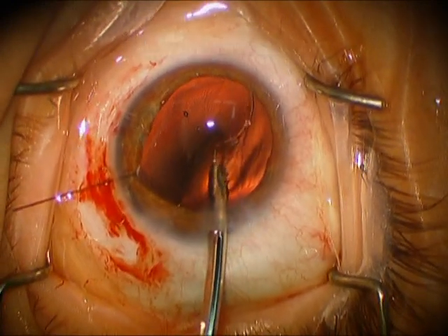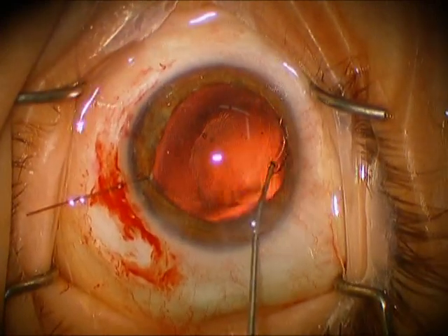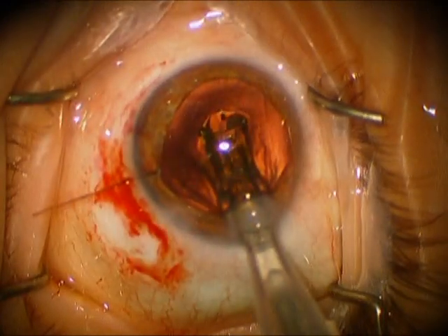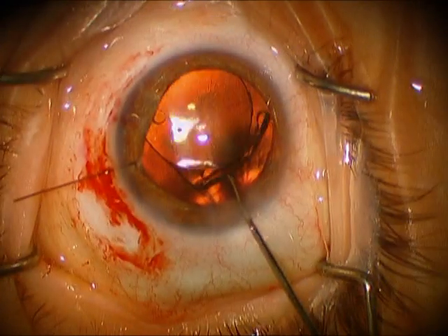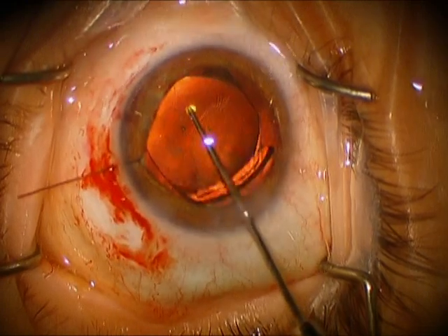You can see as it releases here, it doesn't quite get into position — it gets caught by the iris — but we're going to use a Sinski hook to get it into its final position. So now we're placing a single piece acrylic lens with the capsular tension ring, which is nicely centered now and appears to need no additional support of the bag.